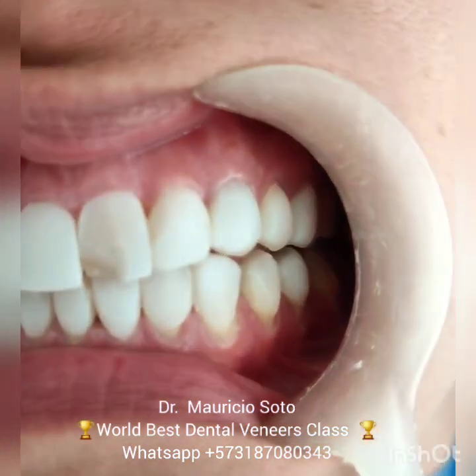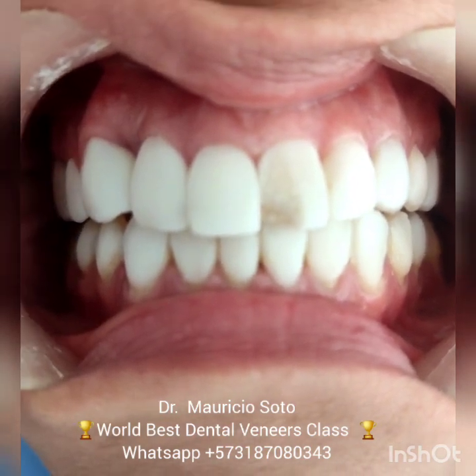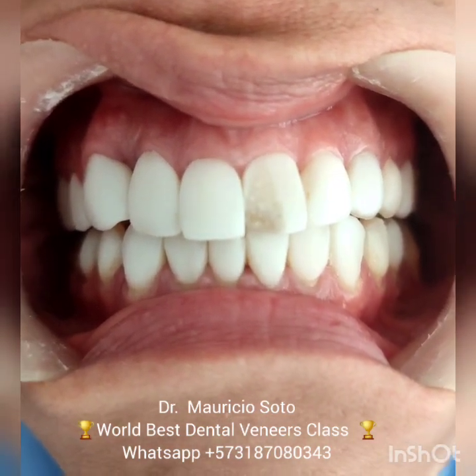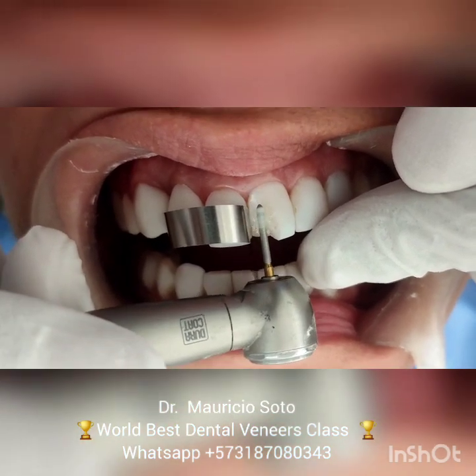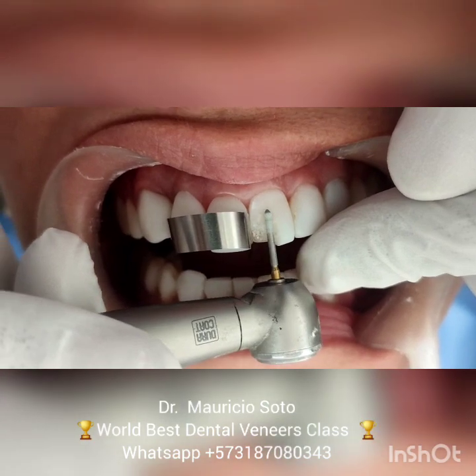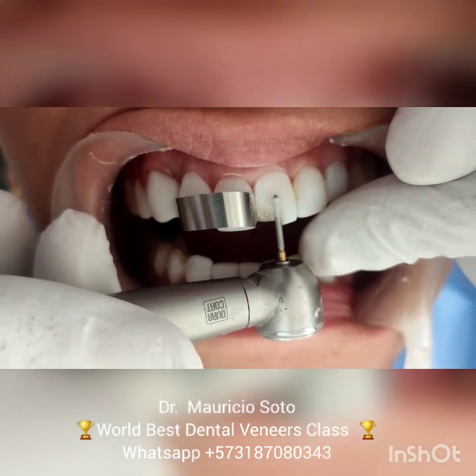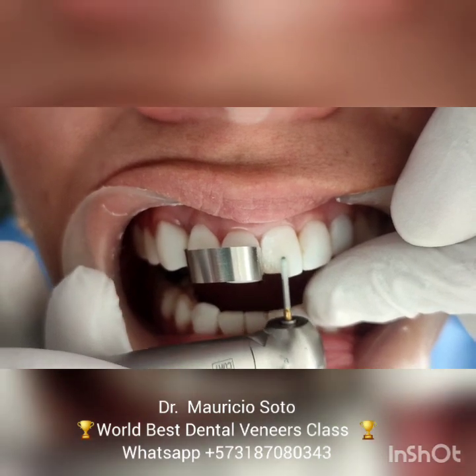This is the situation: a fracture in the central incisor. I'm going to show you how to repair it easily. First, we need to abrade the surface of the old composite with a high-speed bur — a conical high-speed bur — to create mechanical retention between the old composite and the new composite.